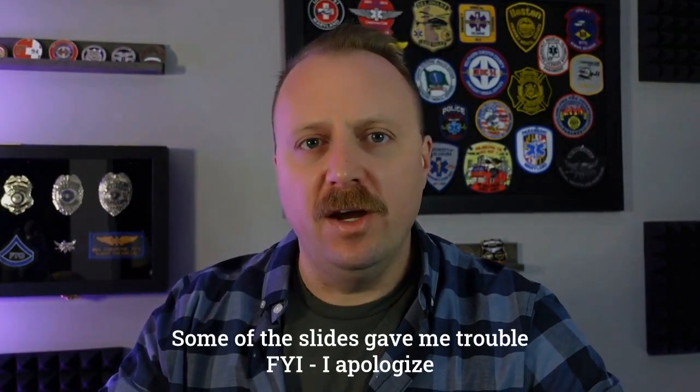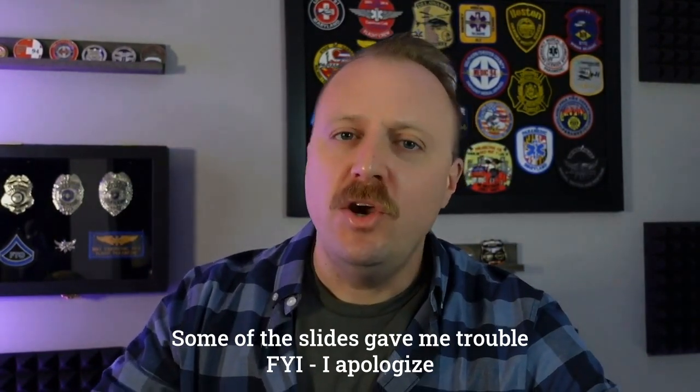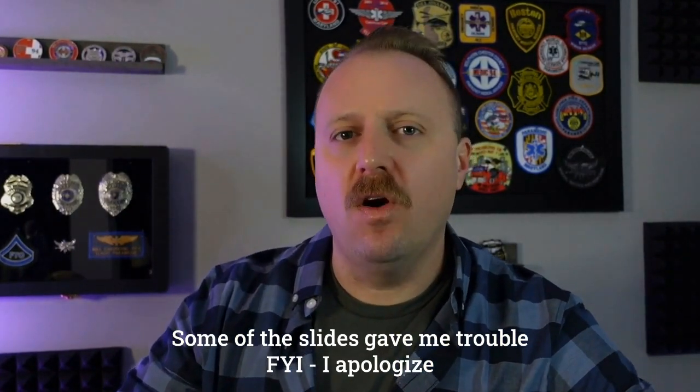I am big time stepping out of my comfort zone with this one. I haven't done a YouTube video like this, but I got challenged by a follower, Nelly from Maryland, to do a video on how to interpret an EKG strip. So here goes. This is not going to be perfect. This is not going to be all encompassing. You're not going to walk away from this video knowing with confidence how to read an EKG, but here are some of the basics.